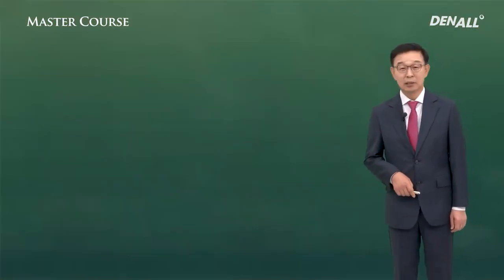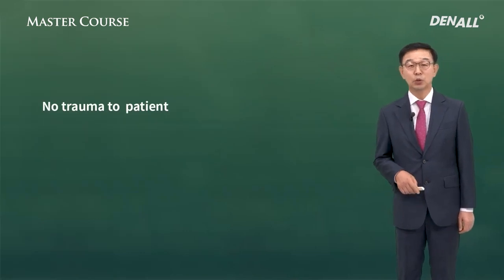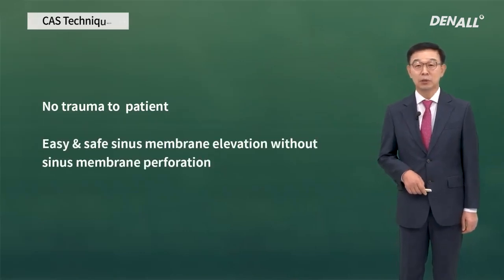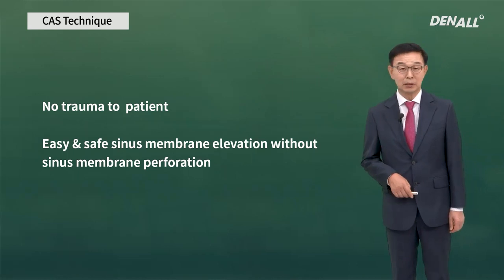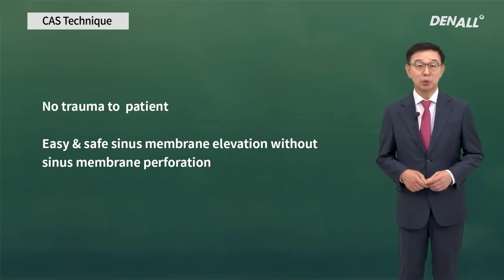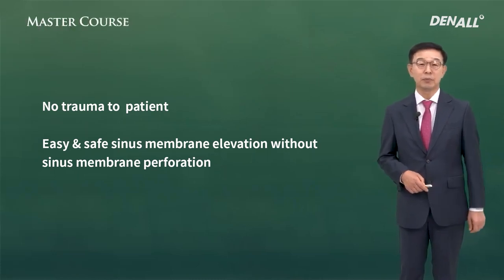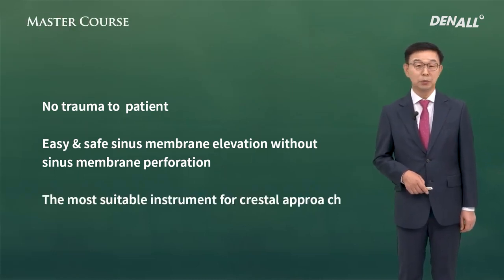The best way to do crestal approach is to minimize patient trauma and maximize the surgeon's satisfaction. In that respect, if you use the CAS kit for crestal approach, you'd be able to do it without sinus membrane perforation in a fairly easy and safe way, and this is an optimized tool for that.